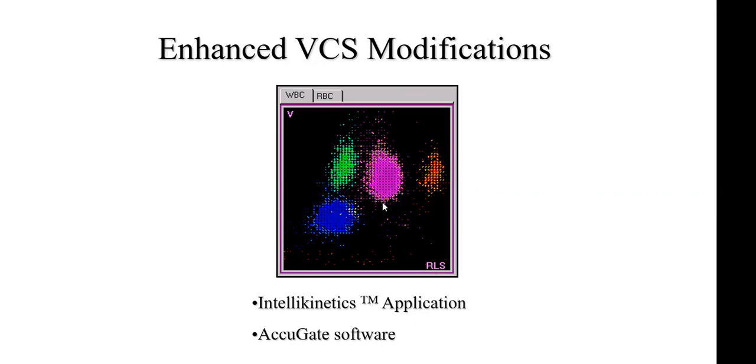Next population, who will guess this? Yes, Astha. Which is this pink population? Anybody else can try? Yes, Charu? Ma'am, this is neutrophil. Yes, this is neutrophil. Very nice. So why is it neutrophil? Because here the volume is similar to that of the monocyte. But as you can see, the scattering has increased. This is because of the granules, which are azurophilic granules, present in the neutrophil.